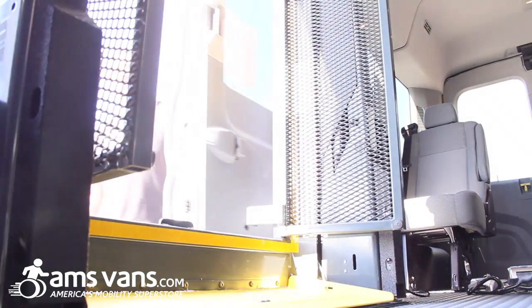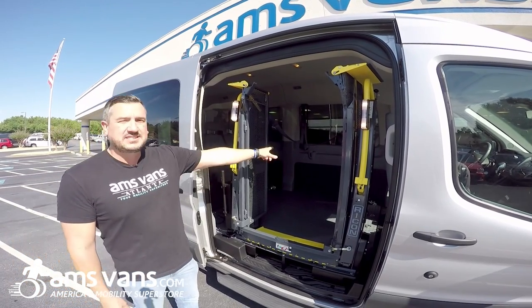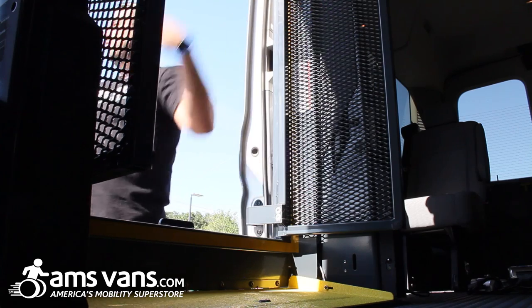Today we're going to show you the same application — side entry — but it's going to be the Clearway split platform lift through Rikon. Open this door and show you how it works. What's different between this lift and the other is it does split in half, making it easier for a loved one to get in without having to operate the lift.